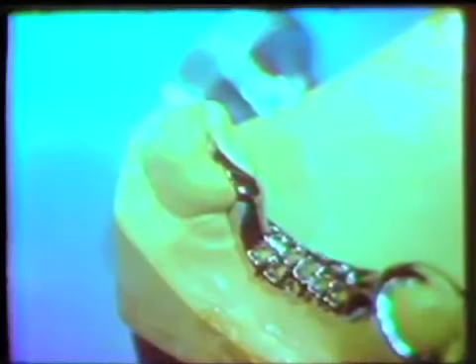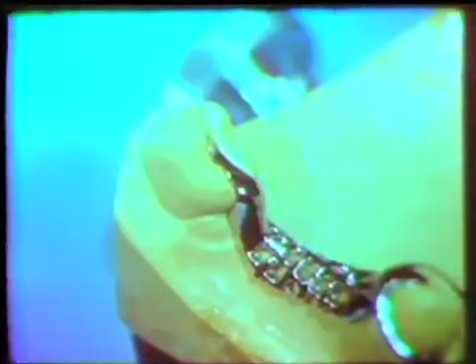A close-up view of the retentive assembly on the mandibular right molar shows the minor connector engaging the undercut. The thickness of the minor connector in this instance is somewhat excessive and should be reduced. Notice that a slight space exists between the bottom of the minor connector and the underlying tissues. The gingival aspect of the minor connector should always be relieved lightly so that its base will not impinge upon the free gingival margin.